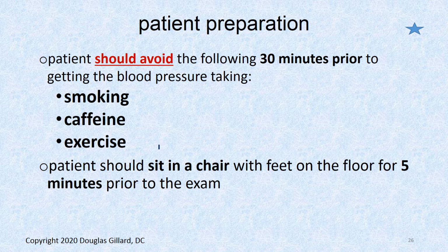Supposedly the patient should avoid smoking for 30 minutes because that can artificially raise it. Also caffeine and exercise. You want them kind of quiet. They should be sitting in a chair for 5 minutes before the exam, just relaxing.